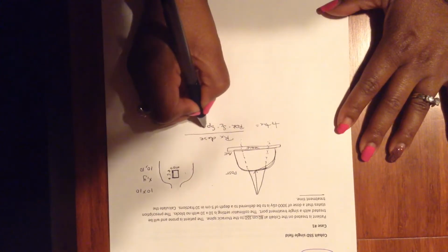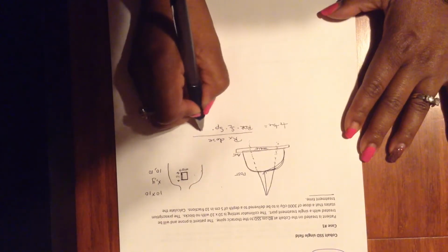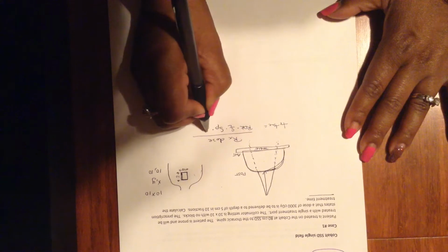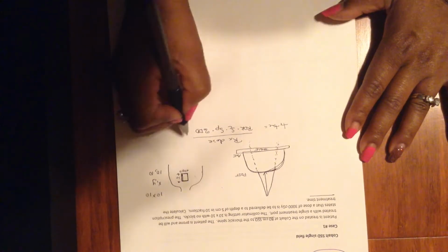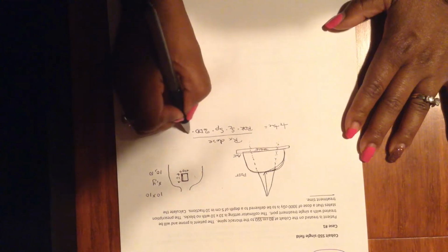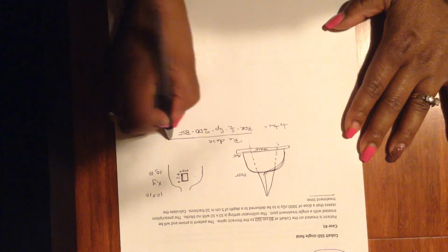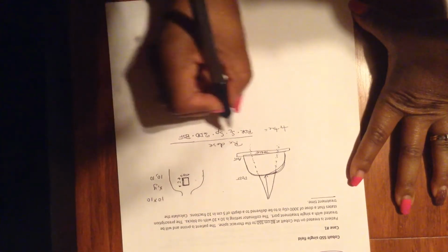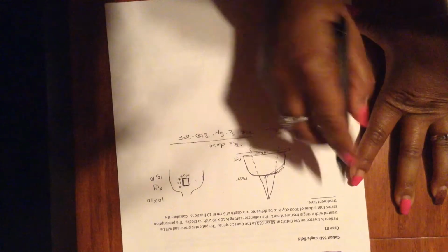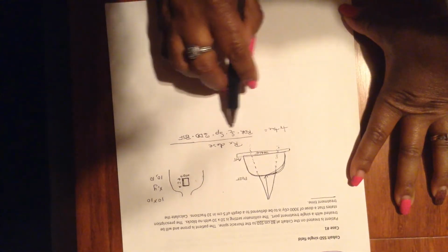And then we're going to need any attenuators, but we have no attenuators. There are no blocks. We're going to need percentage depth dose because this is an SSD technique. And then we're going to need the backscatter factor, or what's known as the peak scatter factor for higher energies above 400 kV. So this is what we're looking at for case number 1. This would be our formula. These are all of the factors we need.